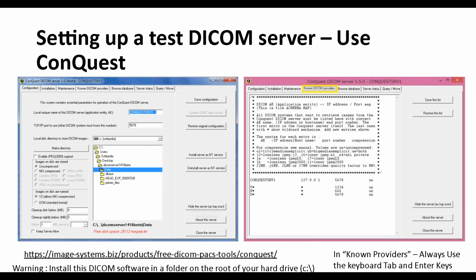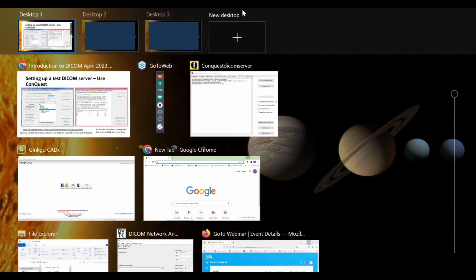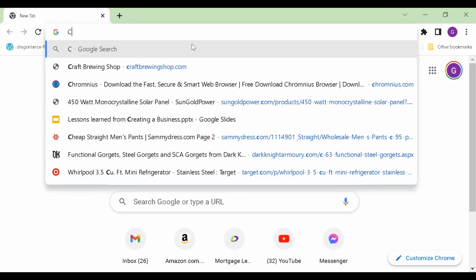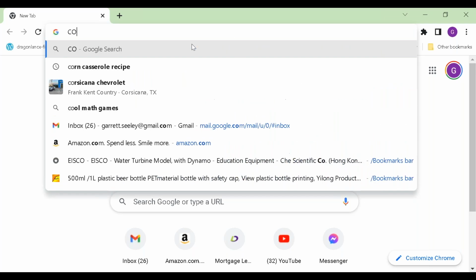Okay, moving along here. Let's go to the server. There's a lot of DICOM servers out there to learn on. For years, I've used this one. It's free. Is that everyone's favorite four-letter F word, right? Free, okay, yeah. Okay, we'll leave the dirty jokes aside. Let me go ahead and point out this. There's the place you can download it, this image systems. I'm going to make this easier for you. Its name is ConQuest DICOM server. So I'm going to go to the web. Let's go to the web. ConQuest. Oh, I got my caps on. I still got my caps on.